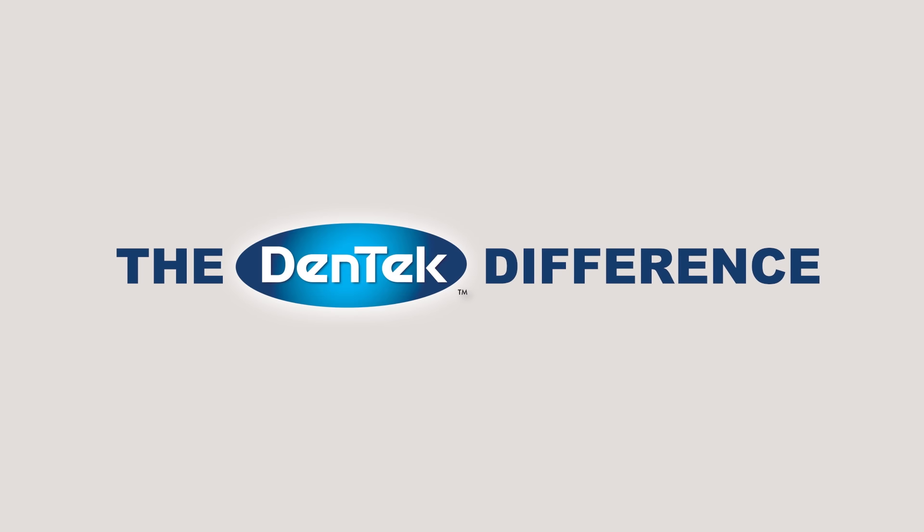Make sure your guard fits correctly. If it doesn't for any reason, repeat this process beginning at step one. Now your professional fit guard is ready to use. Enjoy a restful night's sleep with exceptional comfort and protection. That's the Dentec difference.